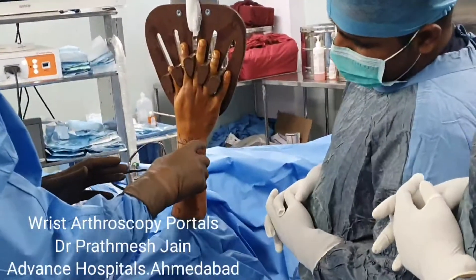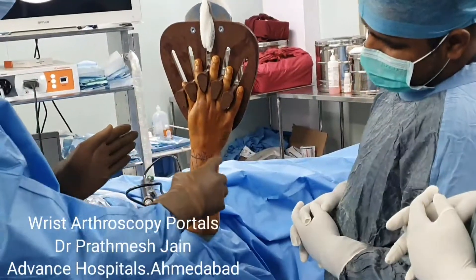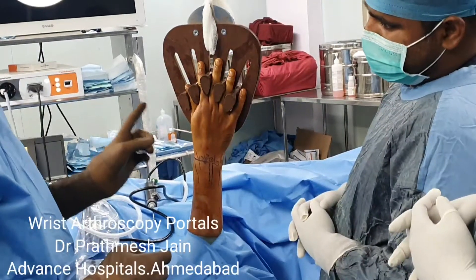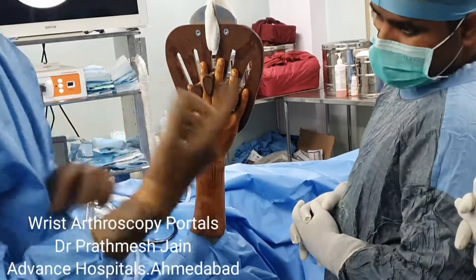The radiocarpal space can be divided into portals. Based on the extensor compartments of the wrist, you can have portals at 1-2, 2-3, 3-4, 4-5, 5-6, and 6 — giving a total of around 6 to 7 portals.